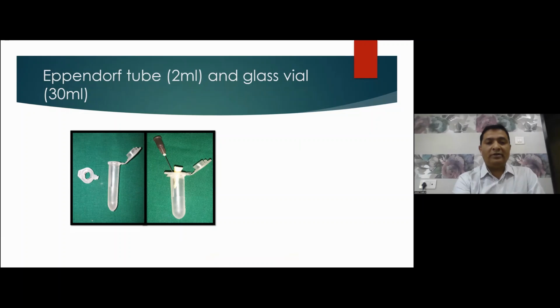The tooth is then mounted on the tube lid. A 26 gauge needle was passed alongside to balance the internal and external pressure and also allow apical extrusion during instrumentation, and cyanoacrylate gel was applied to obtain a fluid-tight seal during instrumentation.